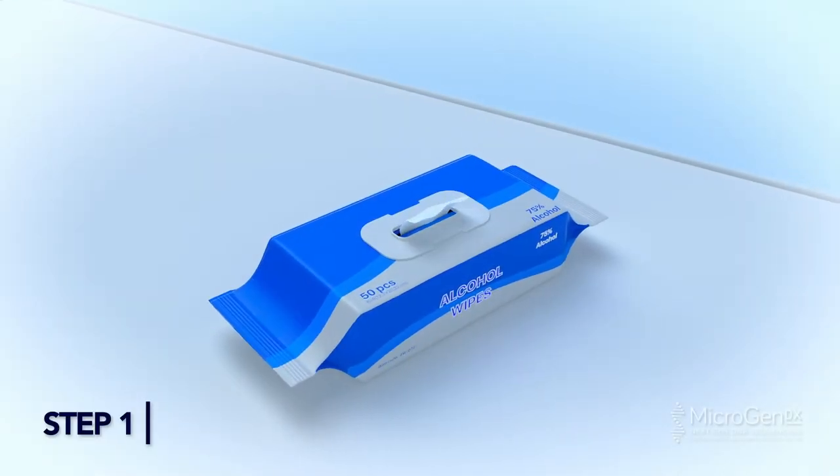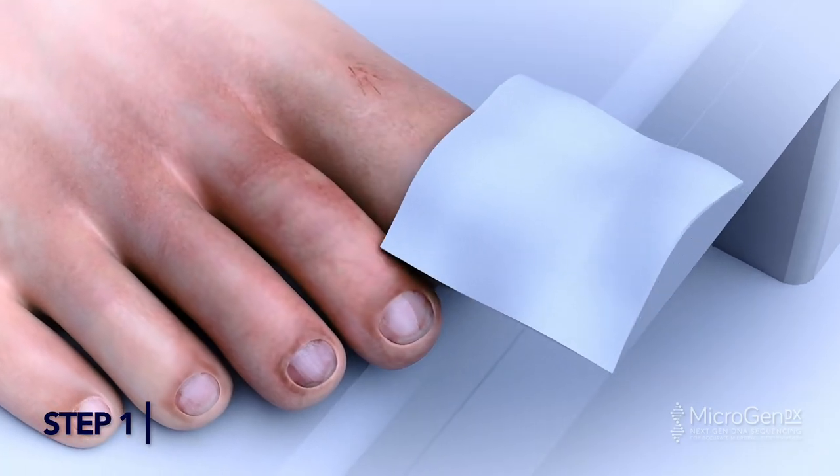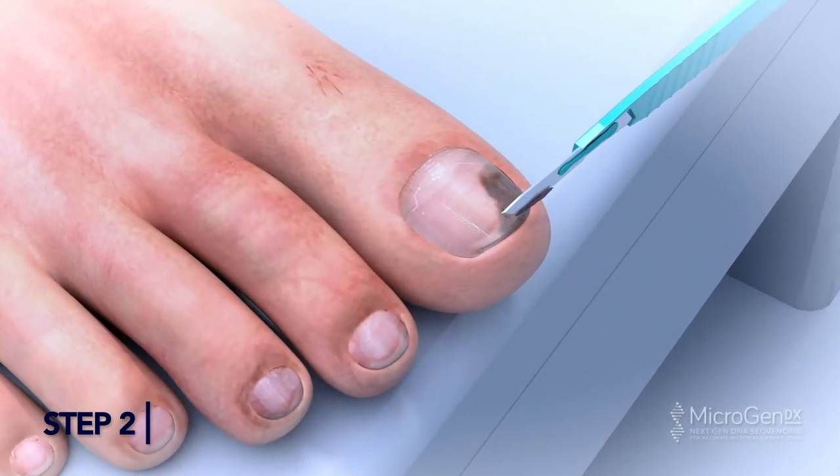Scrape Nail Method. Step 1: Clean nails with alcohol wipes. Step 2: Use a scalpel to scrape the top nail bed to collect shavings.